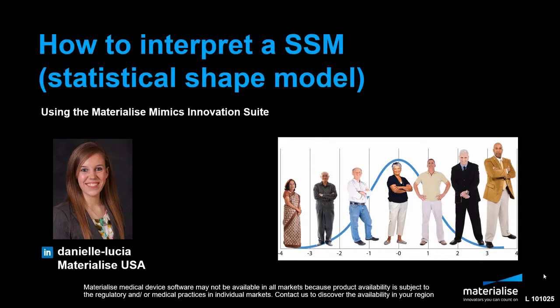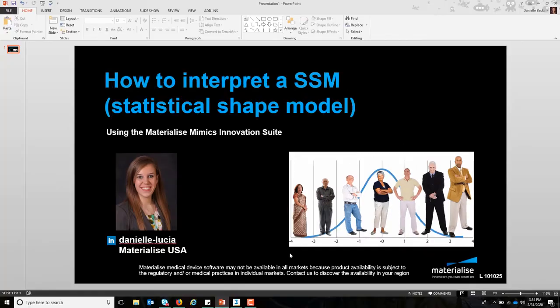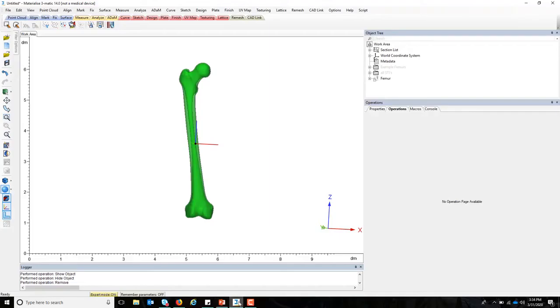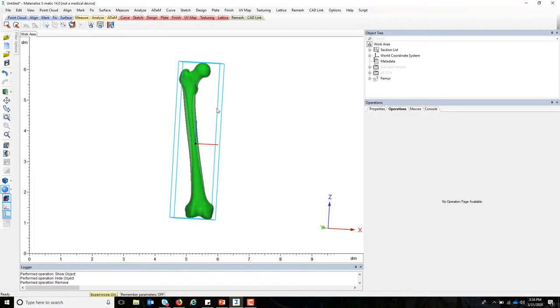And so how can you as a medical device manufacturer start to understand what these models look like and how to design a device that best fits this population? What I'd like to show you is the 3MATIC software, and in this example, I'll explain to you how a femur can be used in a statistical shape modeling sense.